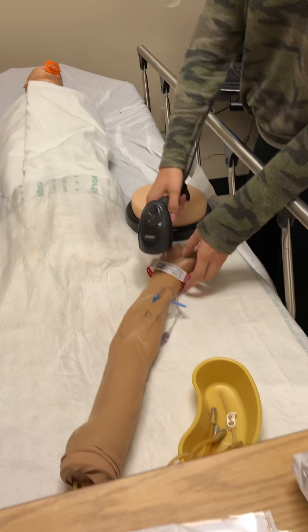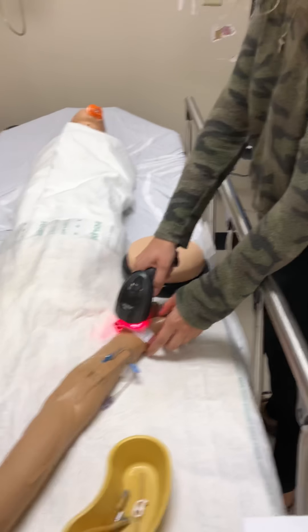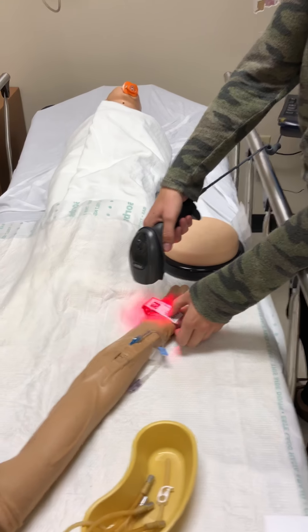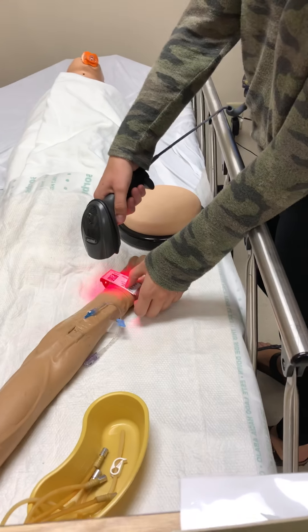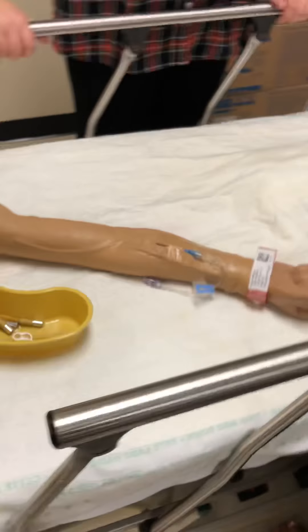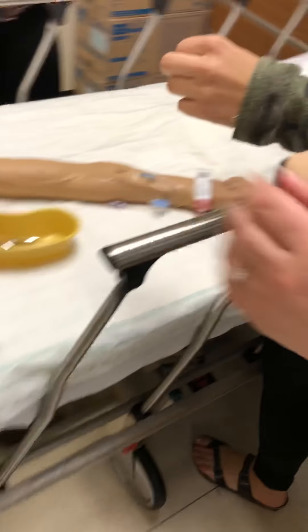We have to scan the ID every time we give a medication. Click here to scan it. Go through the front and get rid of that, and then scan.